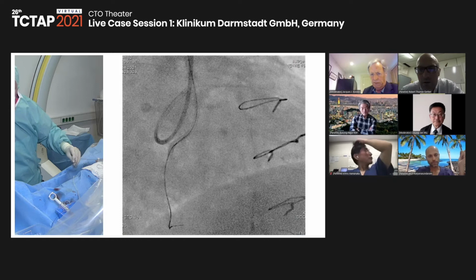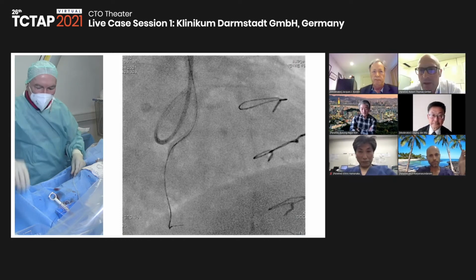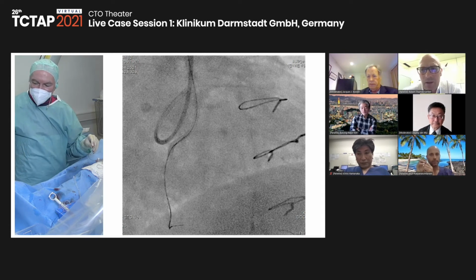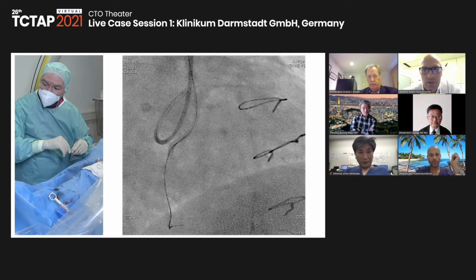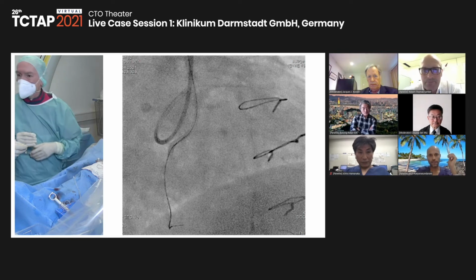Yeah, I agree as well. I think it's been a beautiful demonstration. I just wonder whether the Caravel will give you enough support with the guide. I don't know, I'd probably go with a Corsair or... Yeah, but you will be surprised. This is pre-shaped. That looks a bit more promising to me.